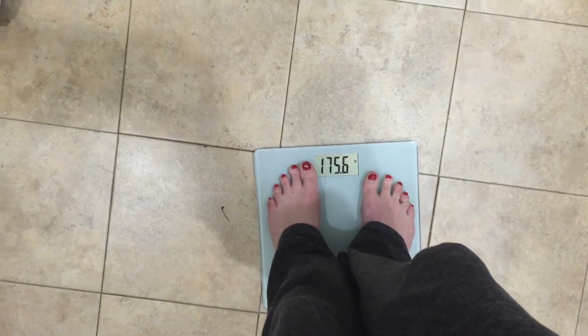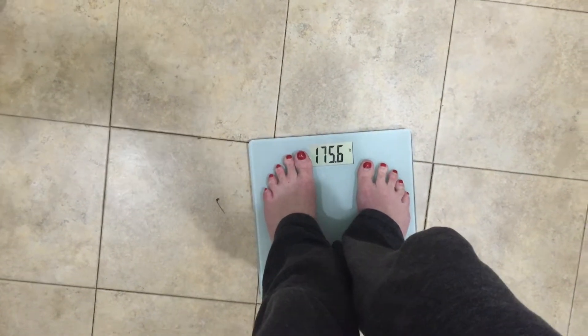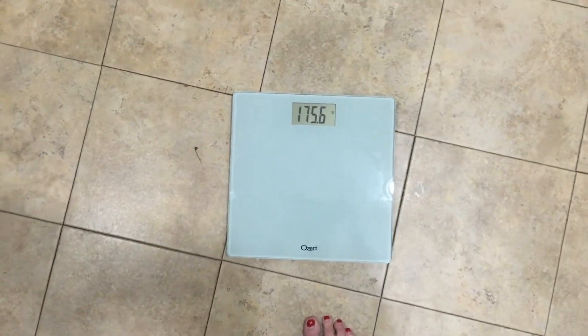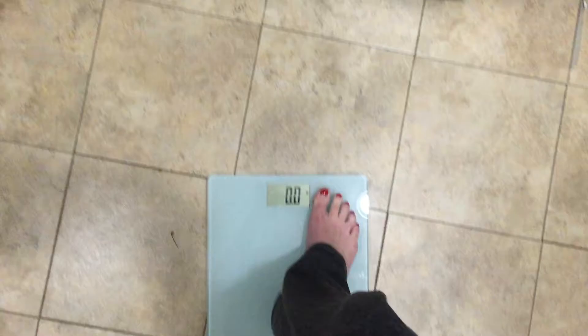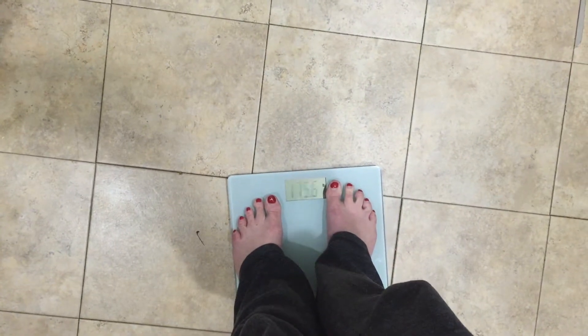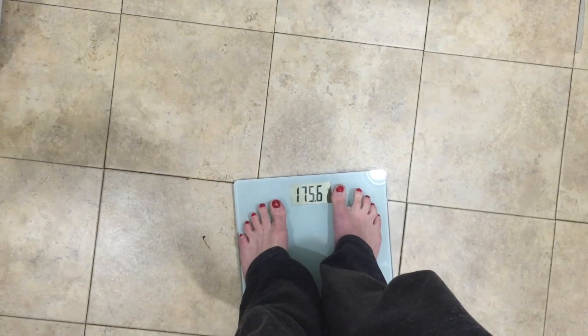I did weigh myself on a regular standard scale yesterday and it gave me about the same result, so I have to say it's a functional scale. It comes with a battery that you can replace. Let's see how much I weigh the second time. Exactly the same.